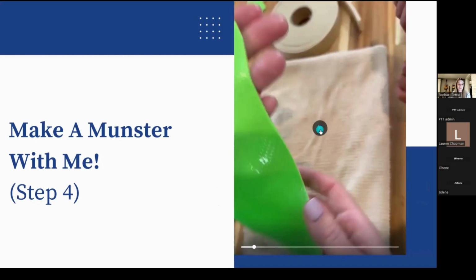So you're just putting it on the towel, you get all of your dripping water off, and then I always test it on my own forearm first to make sure that I'm not going to burn anyone. I've never burned anyone, just for the record, but that's generally speaking what I do. With this material, you do not have to use a stockinette. You can, but you don't have to.